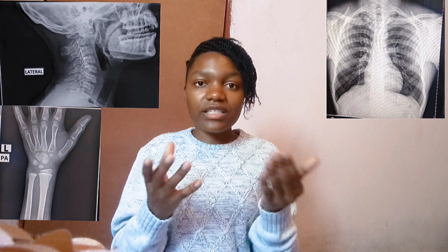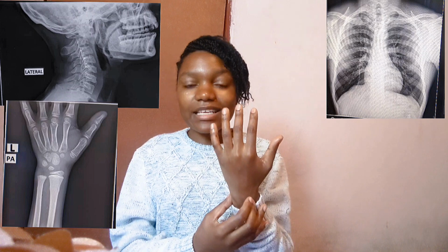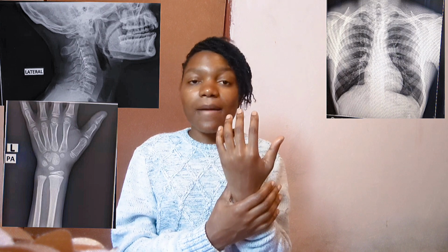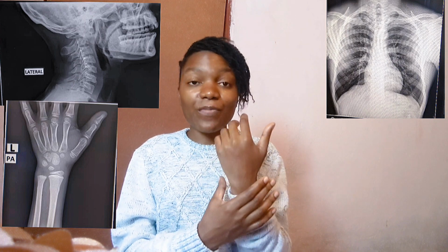For example, that one is the soft tissue. If you have the forearm, you will see the bone, which is denser, it's going to appear white. Then there's soft tissue around the bone which is going to appear grayish, meaning the energy scattered. Half of the energy was absorbed and half of the energy managed to escape from that area.